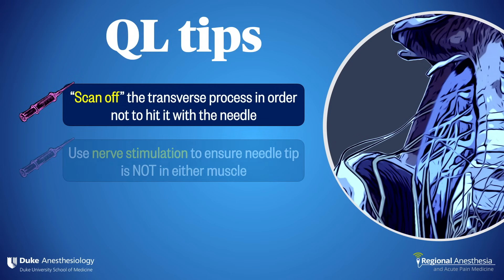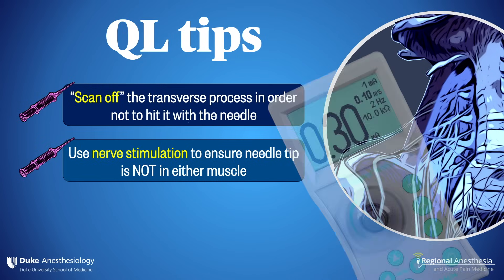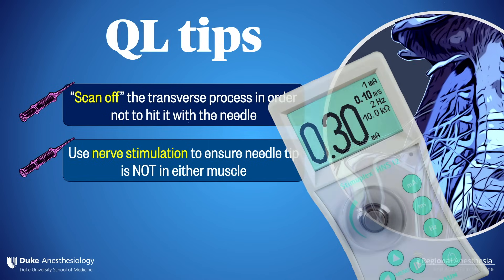Second, there have been cases of quadriceps weakness following QL block, probably due to local anesthetic within the psoas muscle causing a lumbar plexus block. I like to use nerve stimulation to help keep my tip out of QL. I'll turn the current intensity up to 1 or 1.5 milliamps, then watch on the screen as my needle passes through the erector spinae, then the QL muscle, watching for the muscles to twitch with direct muscular stimulation. When the needle passes through QL, it'll stop twitching. If the psoas muscle starts twitching on the screen, your tip is too far — pull back slowly until you're not directly stimulating either muscle. That way you're likely to be in the correct plane.